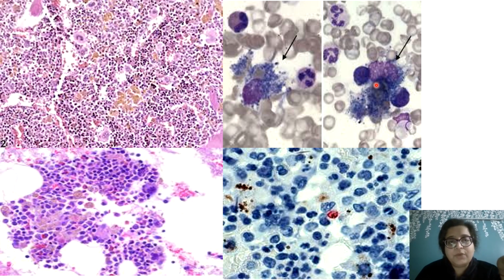So most commonly, when you see an orange or a brown pigment in the marrow, it is hemosiderin, and do a Perls to confirm, and then you can grade, because hemosiderin pigment also denotes the iron stores in the marrow. That is why in a post-transfusion smear, the collection of hemosiderin is increased. Similarly, someone on long-term oral iron therapy might have such depositions. Such iron depositions, once they occur throughout the body, is secondary hemosiderosis.